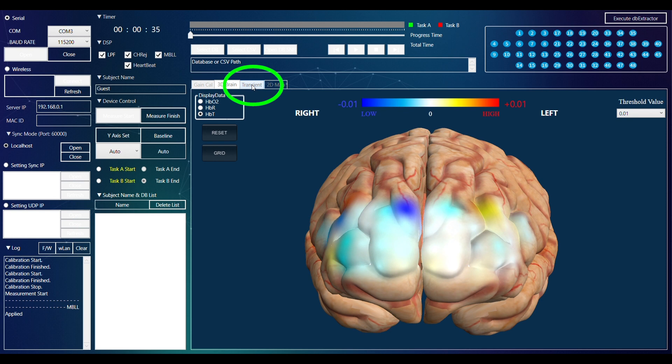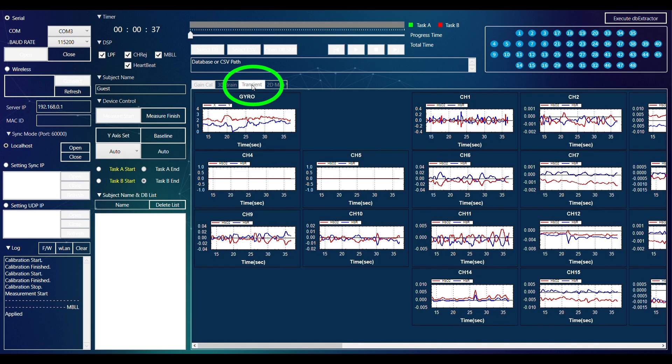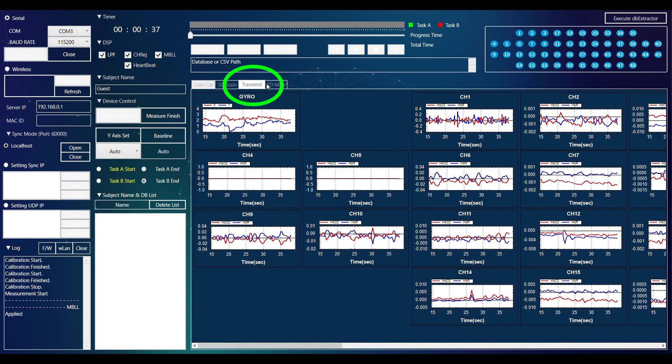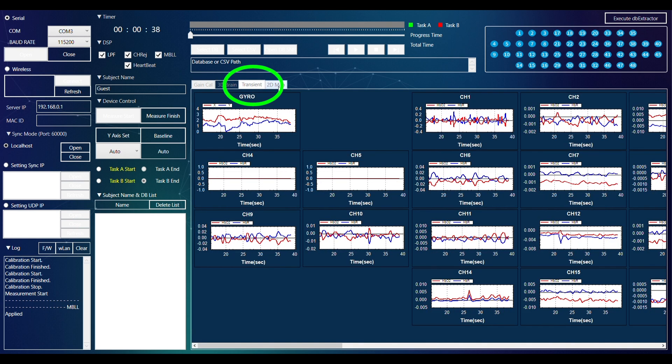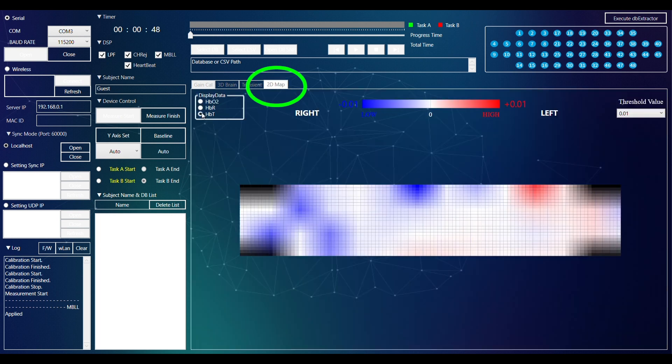You can also display the time series mode under Transient Data, or the 2D Map of the Brain under the 2D Map tab.